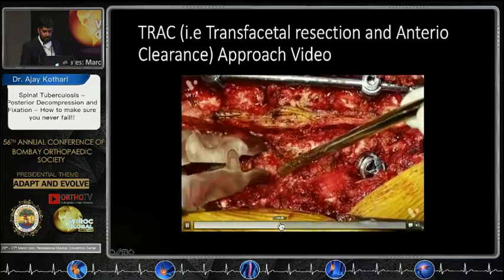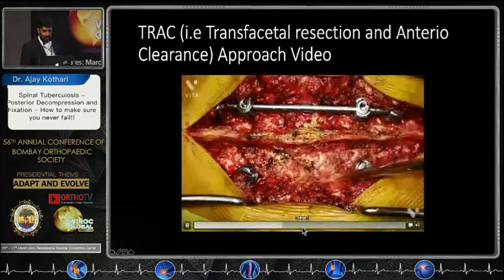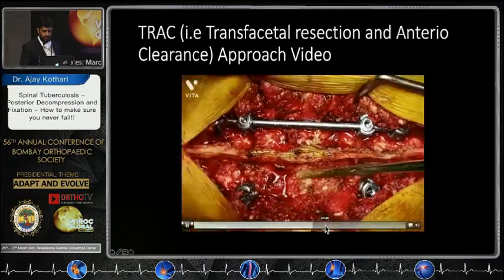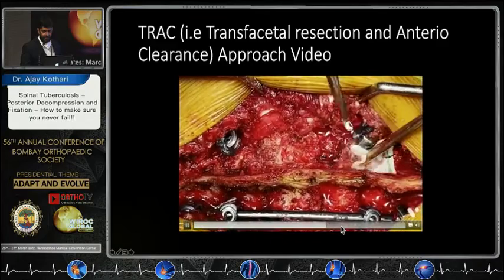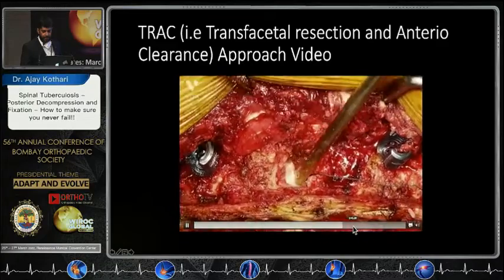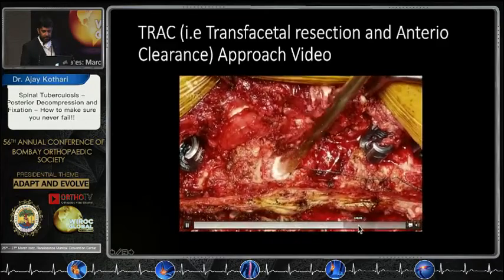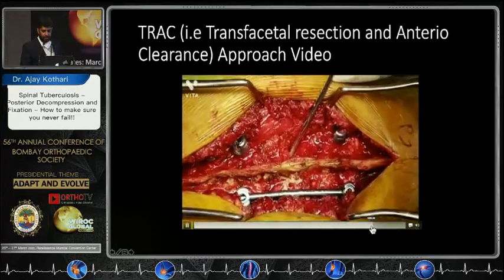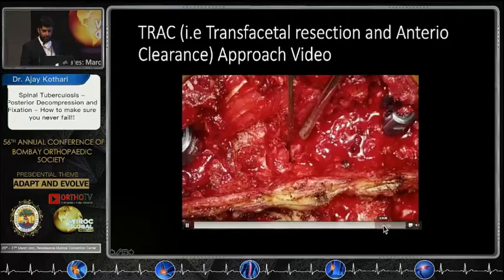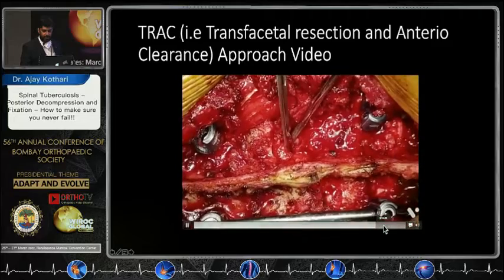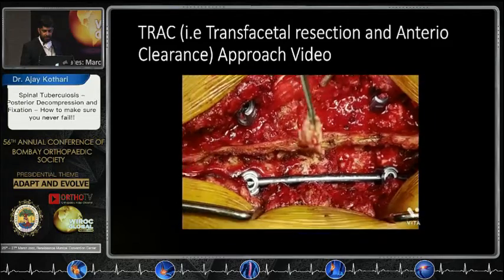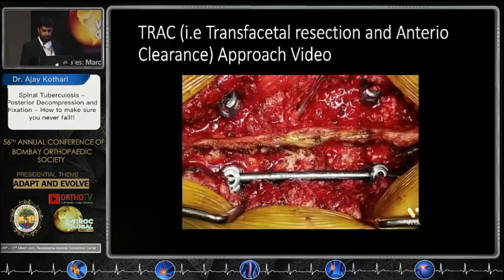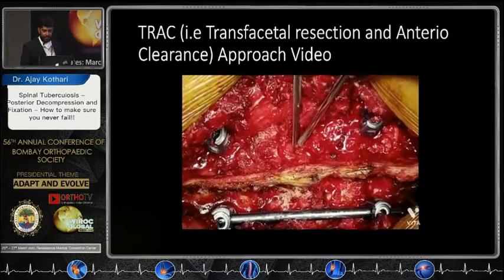Running the video: the rod is fixed on one side, we go from the facet, take the facet out, and here you can see the disease coming out. You can do a complete job, place bone chips and bone grafts, and you do not need to do anterior reconstruction — making failure much less likely.